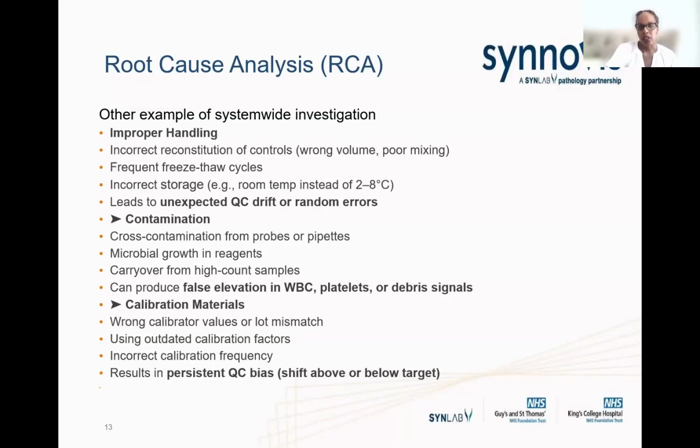We need to make sure staff are trained in how they actually make that sample, not just how to store it. Mixing it, because some QCs will require you to mix every time you're running it. Some of the instruments do mix, but for some of the sample pathways you have to run the sample manually, so you have to mix it yourself.